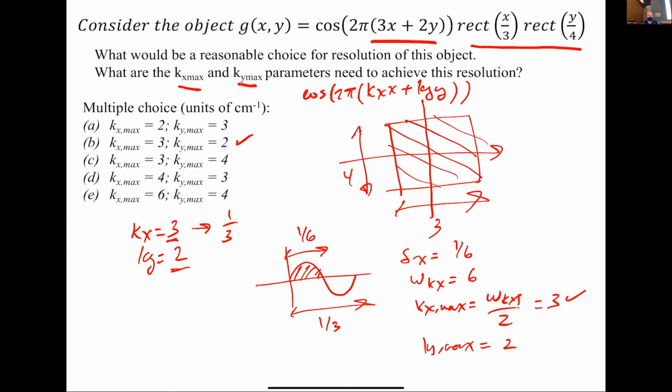So that's essentially, so basically, in the real world, how do you decide on delta x and delta y, right? That's always a good question. Like, how do you know whether you need a millimeter or a centimeter, half a millimeter, 10 microns? The answer is it depends, okay?